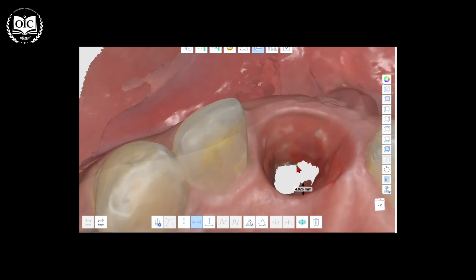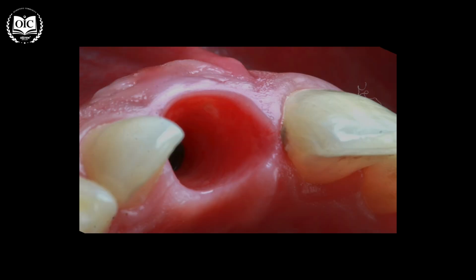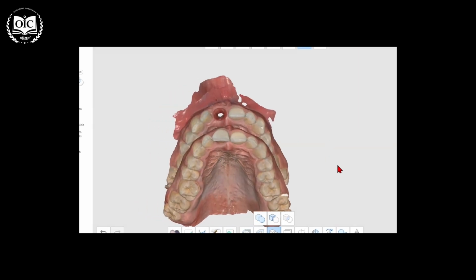This is a declaration that we have planned the depth of the implant in a good position to the future zenith, 5 millimeter, to allow for the grafting procedure, to allow for the curvature of the crown to be gradual, not to be an abrupt 90-degree angle, and to allow a healthy looking emergence profile that satisfies the patient and gives a natural look for the central incisor.